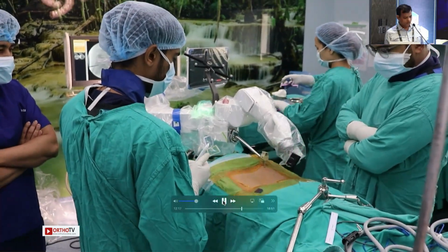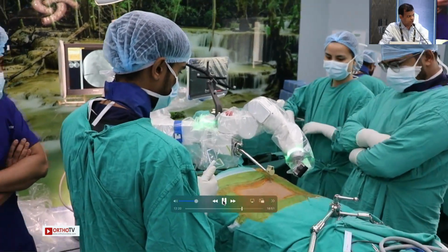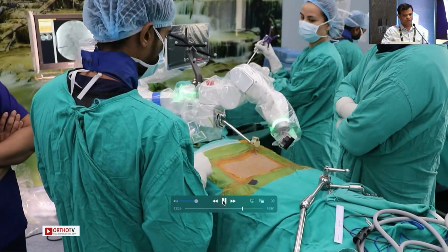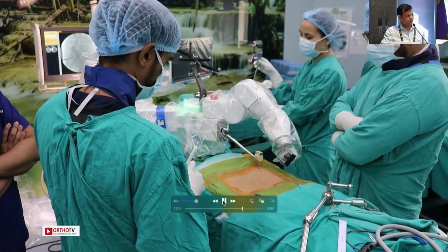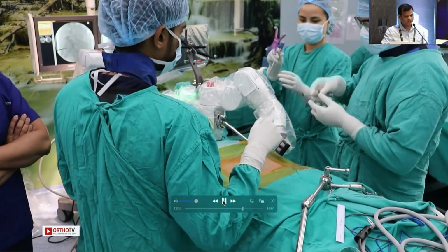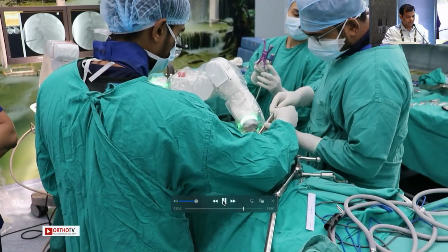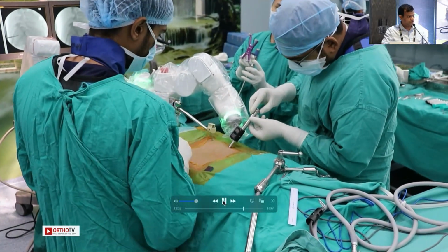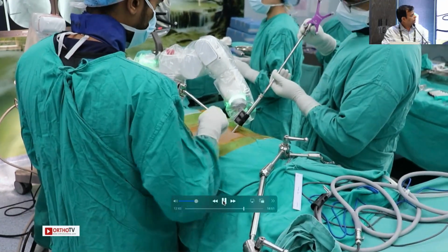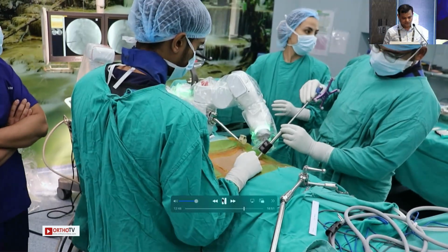And now what I do is, because it's a very delicate surgery, and motion error is very, very common, and that ultimately takes away the accuracy of the robot, I mark my skin incisions first, and then take out the robotic arm, take the skin incisions into the deep fascia, and then bring in the robotic arm again. So this is what my fellow is right now marking, the skin incisions there.